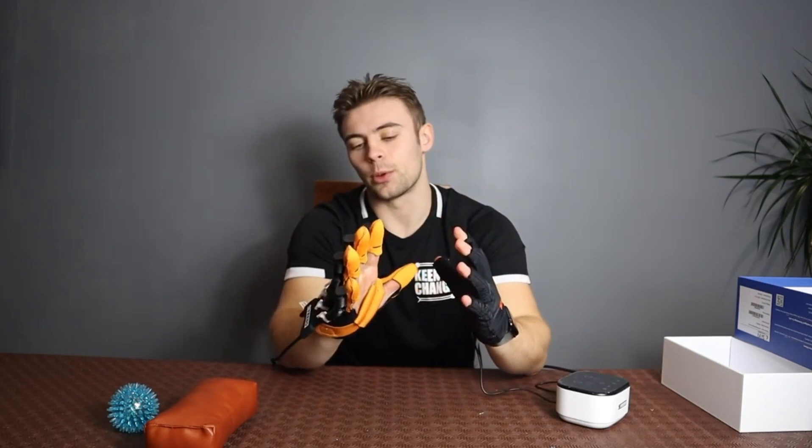This differs massively from what conventional rehabilitation training for stroke patients would normally be. Normally people wouldn't have access to this sort of equipment, and so what CyreboCare does is it increases the accessibility of equipment such as stroke rehabilitation gloves.